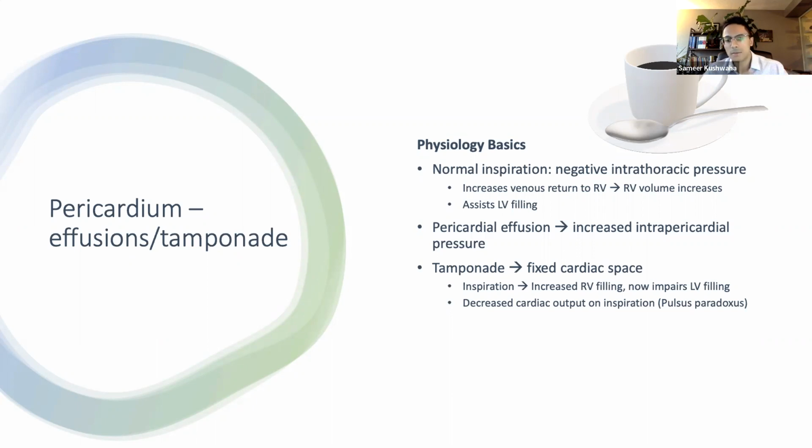this occurs in the confined space, and it impairs left ventricular filling by causing deviation of the septum towards the left ventricle. Because it also acts to shield the heart a little bit from the intrathoracic pressure changes, there is less of a pulling effect on the left ventricle when we take a breath in, and so it is less able to assist the left ventricular filling, which in combination with the changes in the right ventricle, impairs cardiac output, impairs stroke volume, and decreases our blood pressure, causing the classic finding of the pulsus paradoxus.